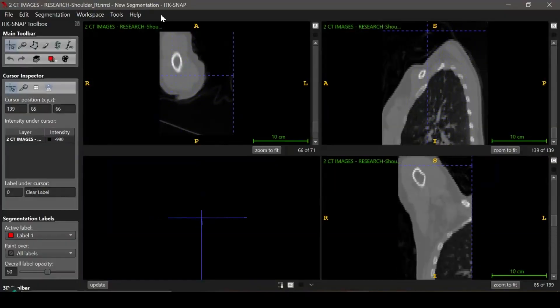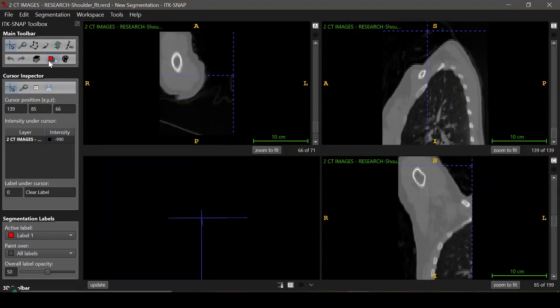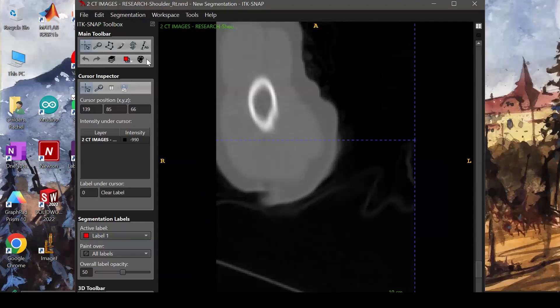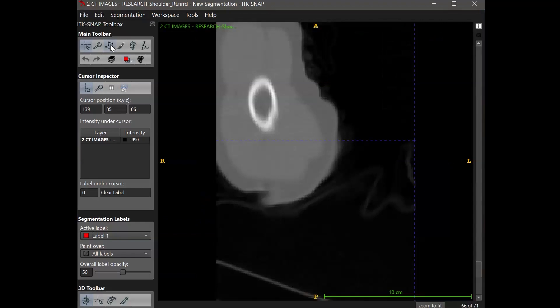To begin image segmentation, we will label different segments. So for this example, I can create a segment specific to the humerus. If I want to pay attention to other parts in the shoulder, I can create labels for those too.